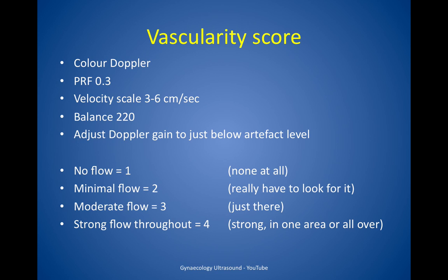Vascularity. The vascularity of a lesion is determined using colour Doppler. It's important to set the right sensitivities: use a PRF of 0.3, equivalent to a velocity scale of 3 to 6 cm per second, a balance of 220, then adjust the Doppler gain to just below the artefact level. No flow is scored as 1; minimal flow where you have to look for it is 2; moderate flow where flow is present is 3; and strong flow throughout or in one area is 4.